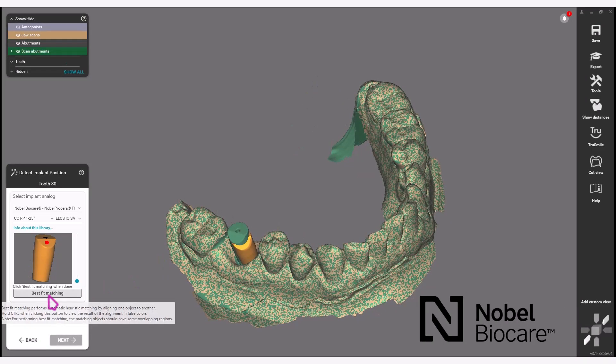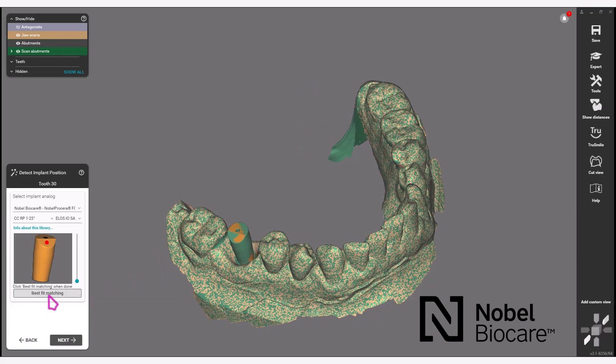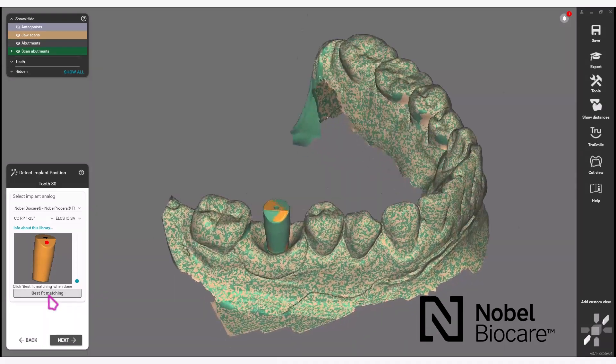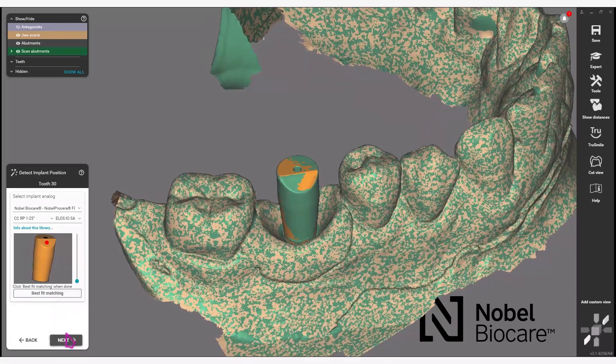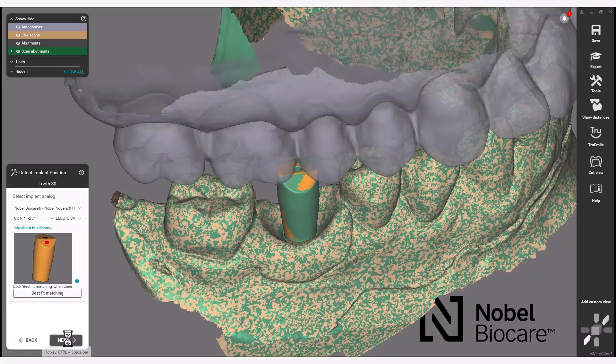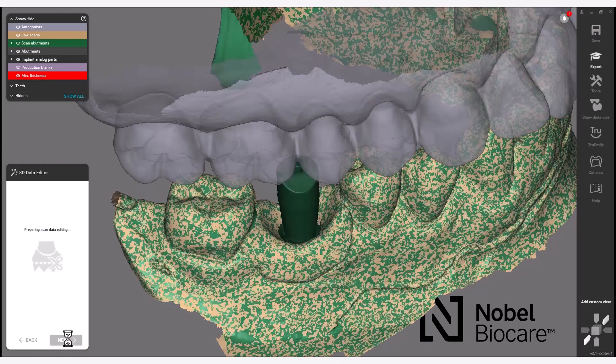Click Best Fit Matching. Select Next in the wizard to proceed.